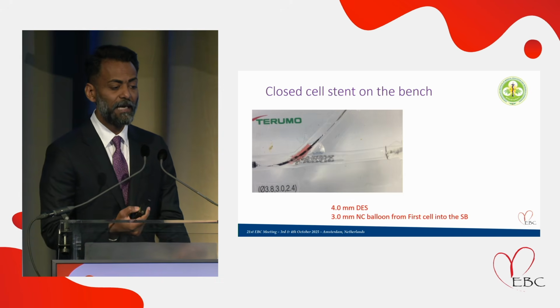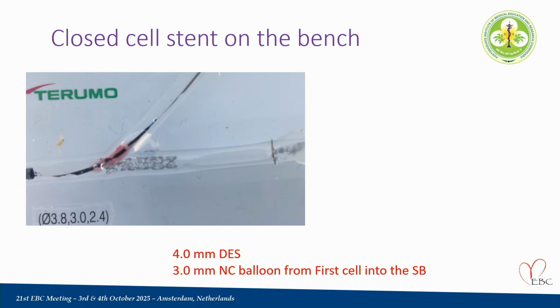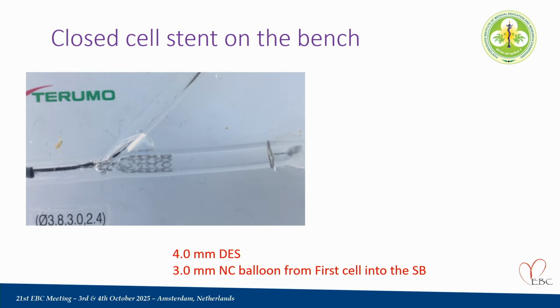Regarding the hybrid stent, I took this stent from the stent company again, and took the stent to the bench. I started dilating the stent on the bench wired from the first closed cell. I was never able to dilate it on the bench as well.